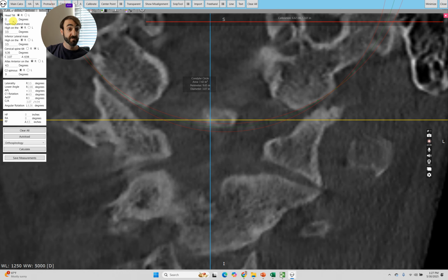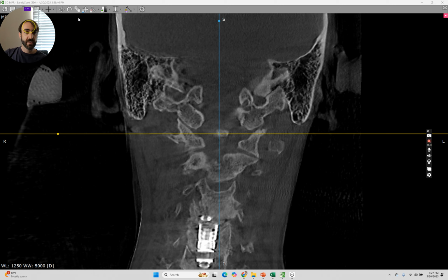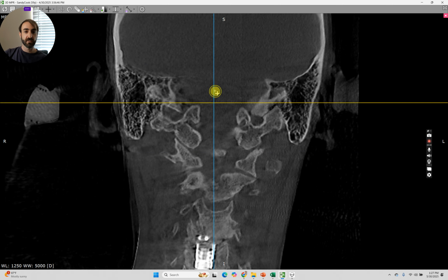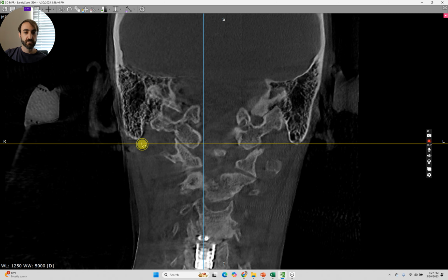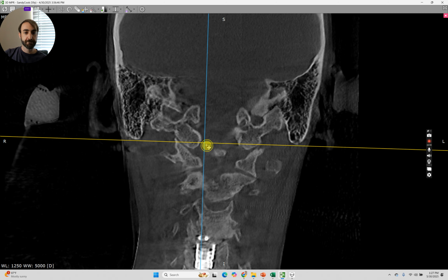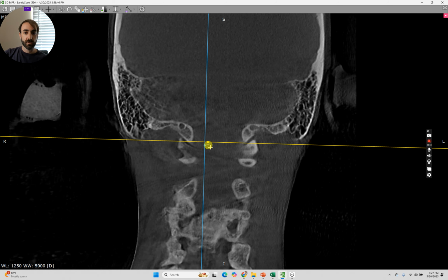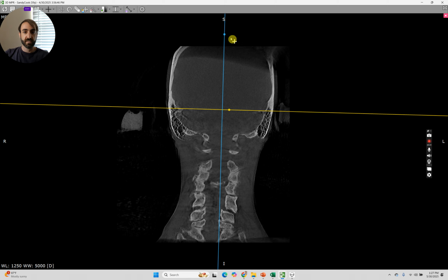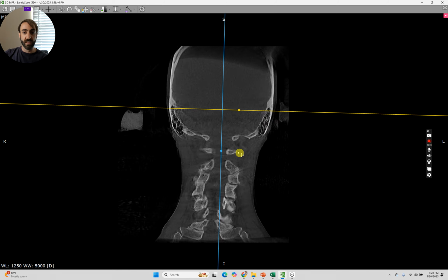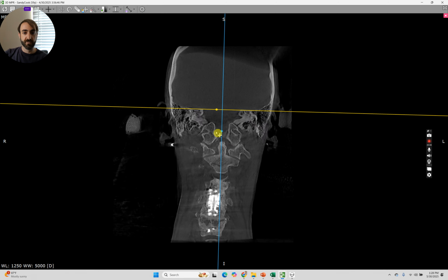So the last thing we're going to measure is head tilt, and the way I'm currently doing that is, again, doing a best fit line using this yellow bar right here. We'll start by just dropping it on the tips of the mastoids like that. And then we'll scroll a little bit deeper, and we're looking at different internal structures of the skull here to see, can we get this to go right through the middle of that brain. So here's the bottom of the skull here.